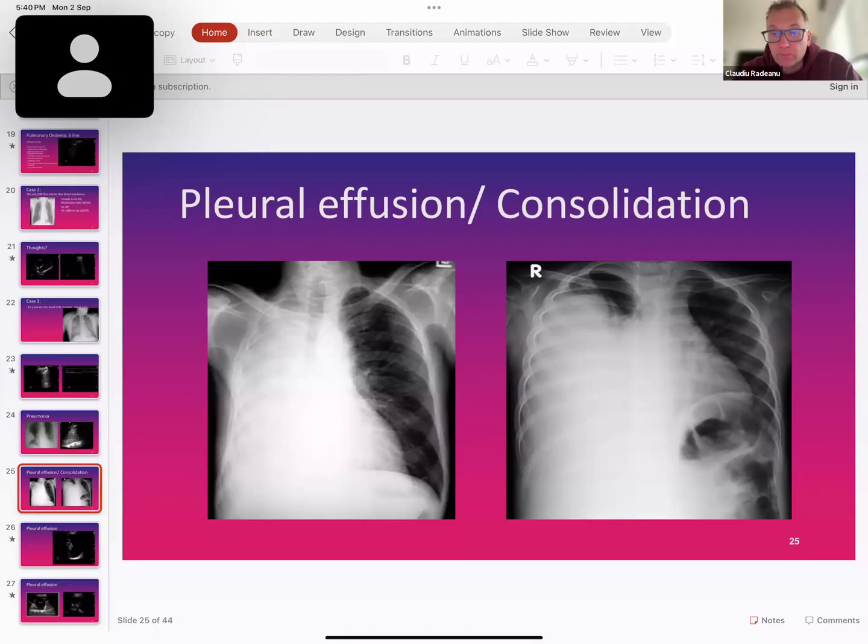You probably see X-rays like this more frequently than I do. But sometimes you don't know how the lung looks. Is it malignancy? Is it pleural effusion? Is it a very large consolidation? Is it an empyema? And that's why the X-ray might not help. CT, yes, it helps you, but sometimes it's very difficult to get access to it. So lung ultrasound is very, very useful.